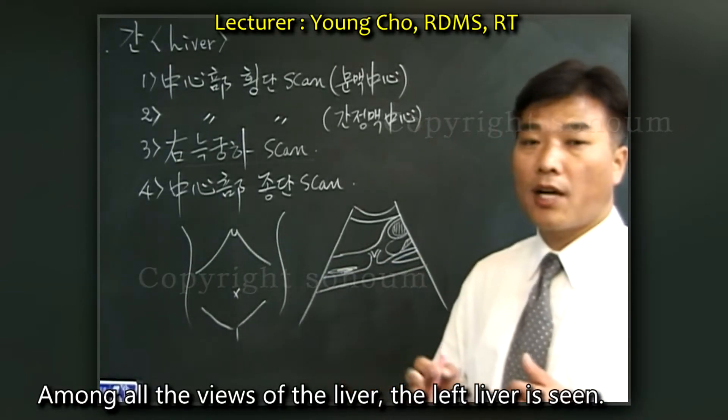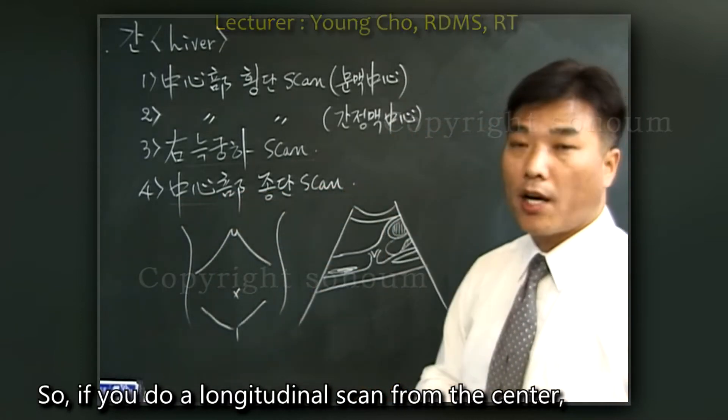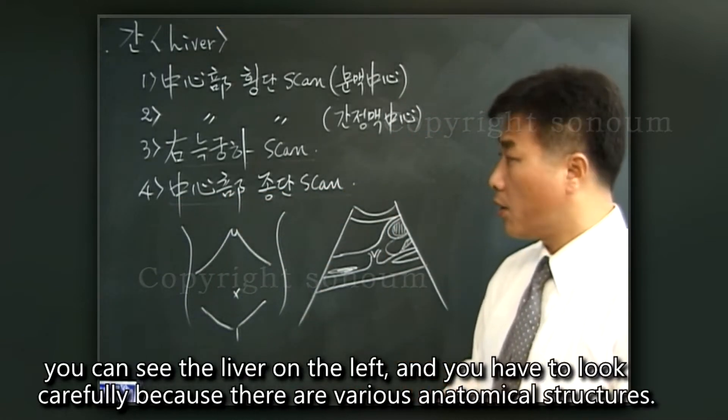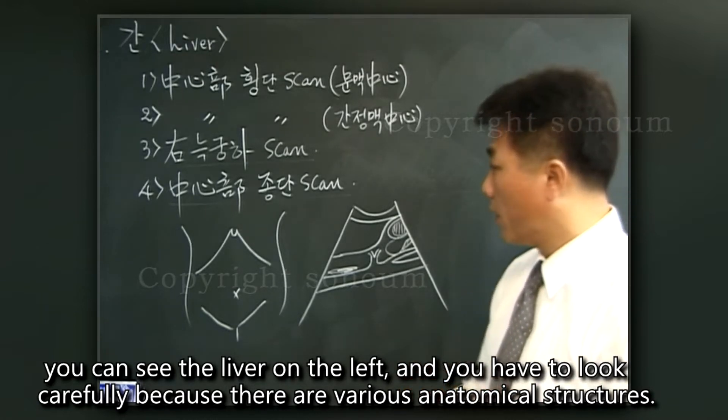Among all the views of the liver, the left liver is seen. If you do a longitudinal scan from the center, you can see the liver on the left, and you have to look carefully because there are various anatomical structures.